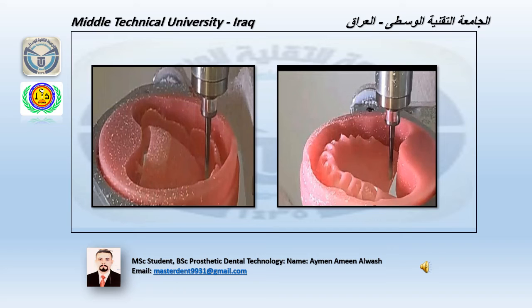Denture base without tooth anatomy will be milled from organic PMMA pink disc. طبعا بعد ما أكملنا خطوات scanning and arrangement of artificial teeth, now we are ready for milling denture base complete denture. الصورة اللي موجودة على اليسار توضح الميلينج بالinner surface for denture base. أما بالنسبة للصورة اللي موجودة على اليمين توضح الميلينج on the outer surface.